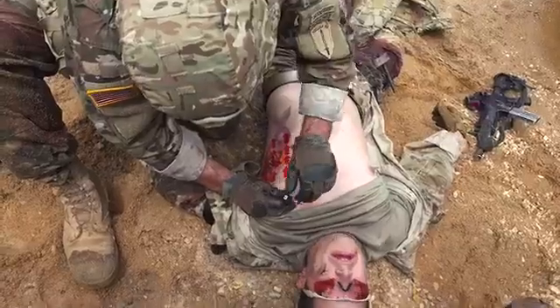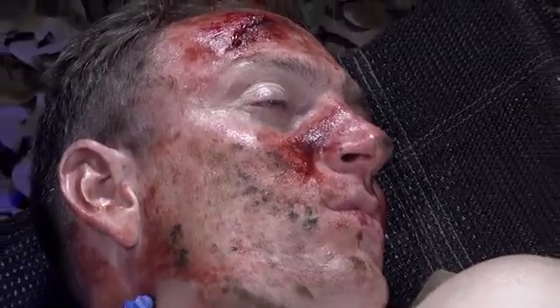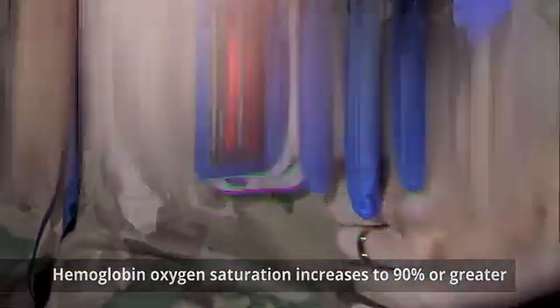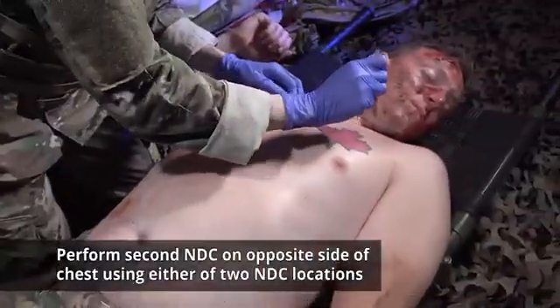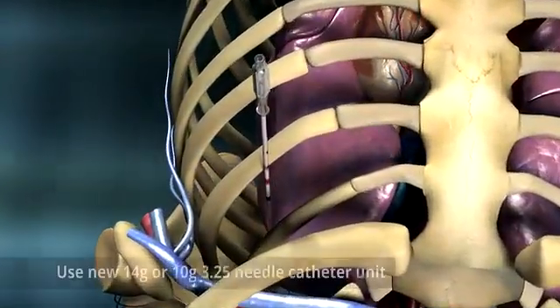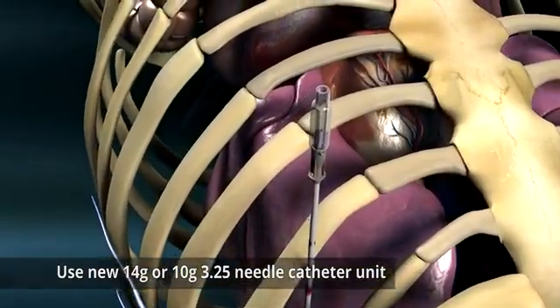This may be difficult to appreciate in high noise environments. A casualty with no vital signs has a return of consciousness and or pulses. Hemoglobin oxygen saturation increases to 90 percent or greater. If the first NDC is unsuccessful, perform a second NDC on the opposite side of the chest using either of the two NDC locations, using a new 14 gauge or 10 gauge 3.25 inch needle catheter unit.